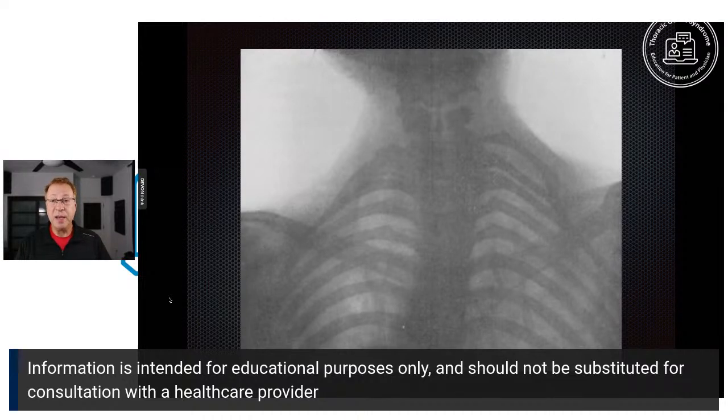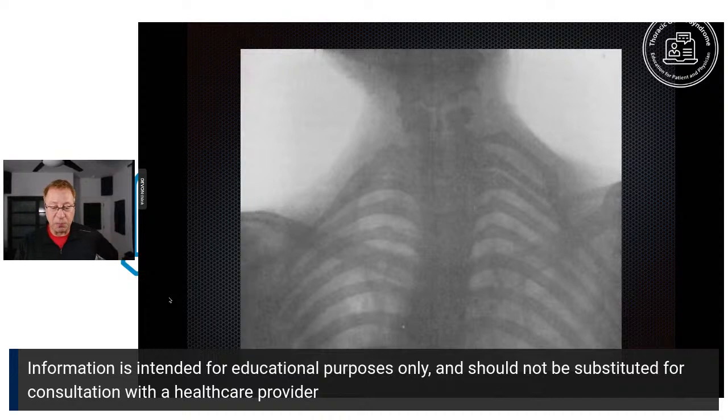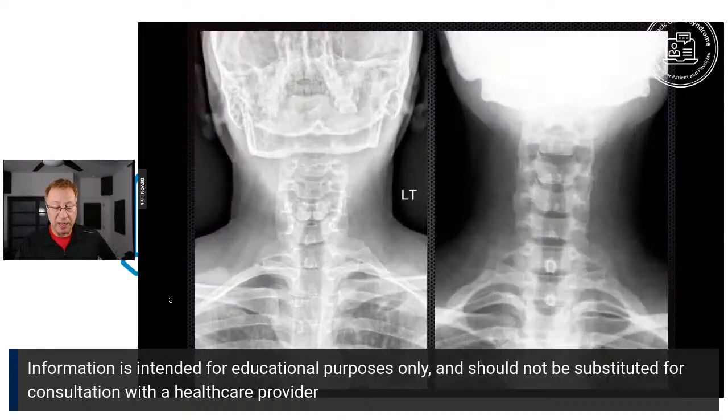To this day, there are a decent amount of docs out there. When you mention TOS, they think cervical rib. And when you mention cervical rib, they think TOS. Obviously, the disease is a lot more complicated than that. There are lots of patients with cervical ribs who don't have TOS. Here's a modern picture. Again, it's better than the previous one if you look at the quality. That's the previous one. But still, the modern one really just shows bones. Shows a little bit of soft tissue, but it doesn't have great detail separating things out.